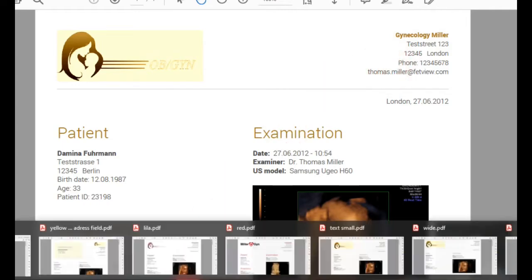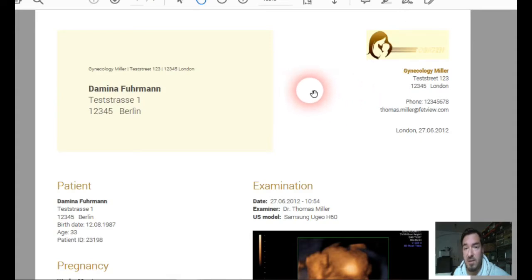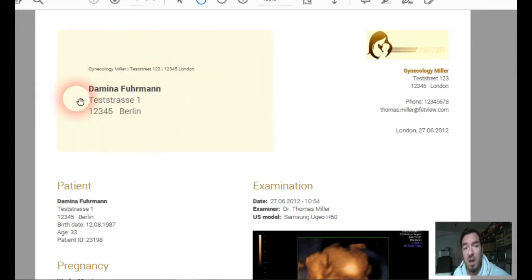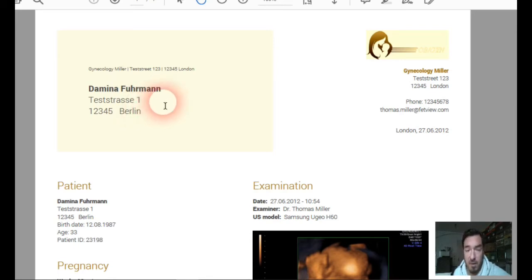The second one is the one with the address field. This is used for printing it out and sending or giving it to your patient or to the referral doctor.